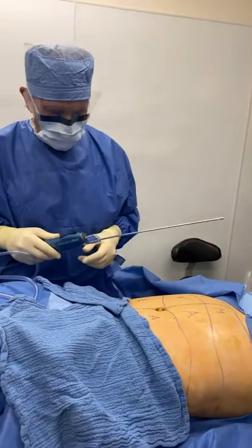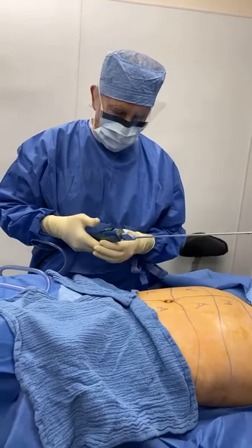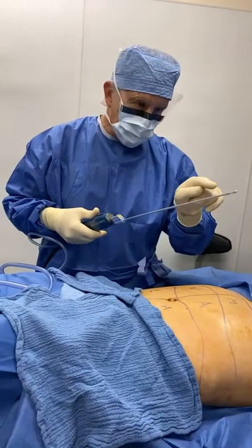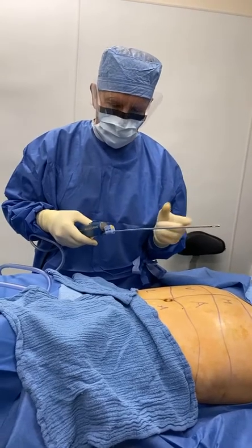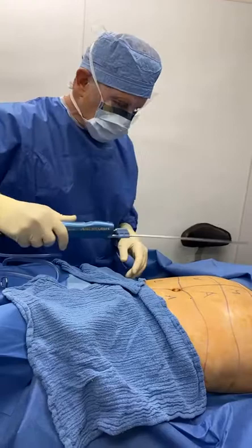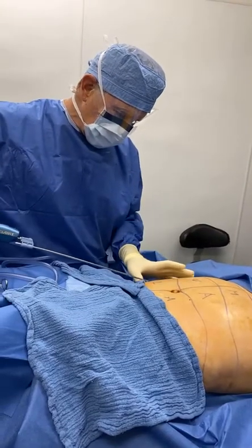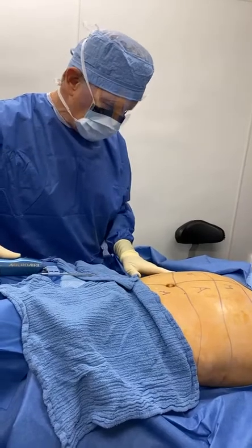Dr. Patino here at the Cosmetic Surgery Center of El Cerrito. We're going to do micro air power-assisted liposuction. Power-assisted because look — you can see how the cannula vibrates, similar to an electric toothbrush. You don't have to be going in and out causing trauma. You just let the tool do its work, and this is how we do it here.